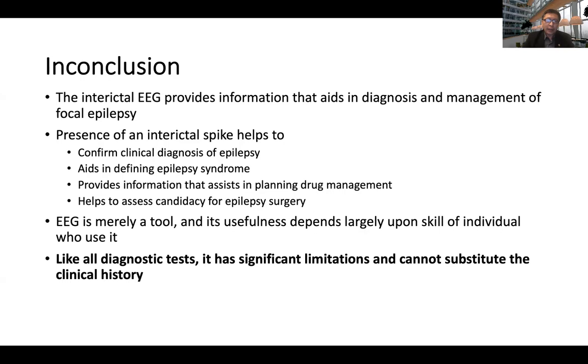Like all diagnostic tests, it has significant limitations and cannot substitute for the clinical history. It has to be used together with the clinical information, and we can use EEG at the end to confirm the diagnosis.